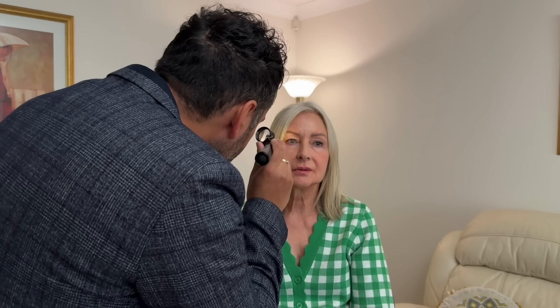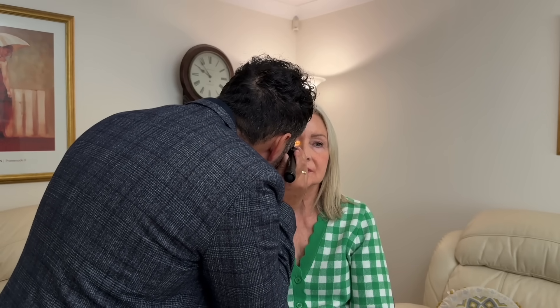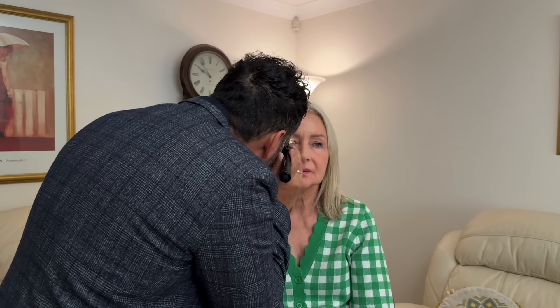Just looking straight ahead — going to do some ocular health checks. First thing is just a bit of grading of the iris. Looking straight ahead at the top of the chart. Right eye is a bit at number 4. So grade 4 right, left grade 5, a little bit of iris pigment.